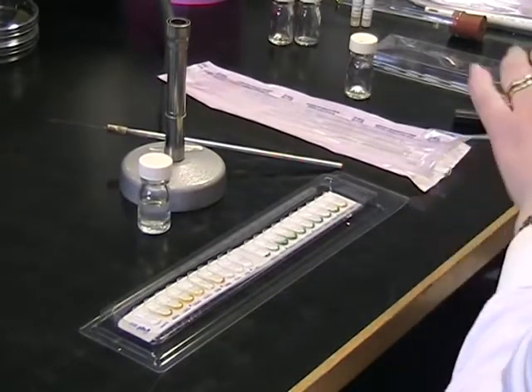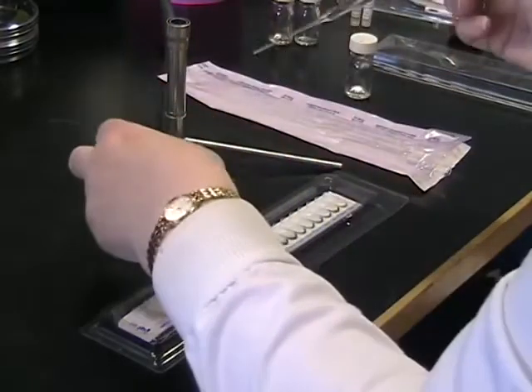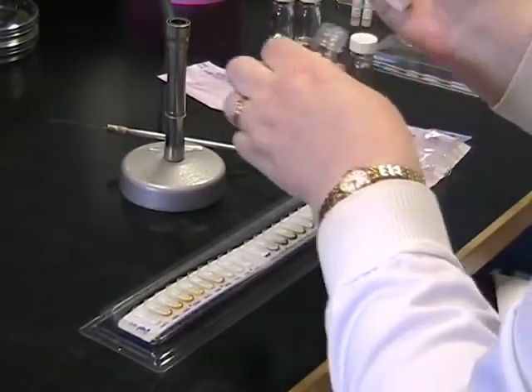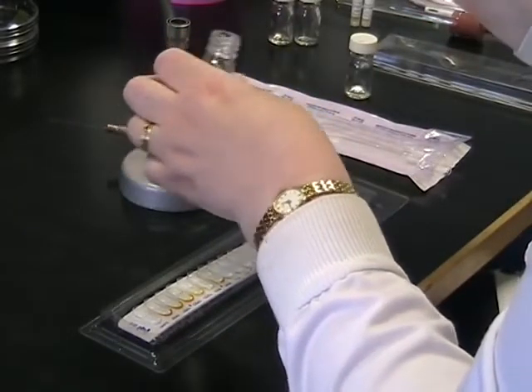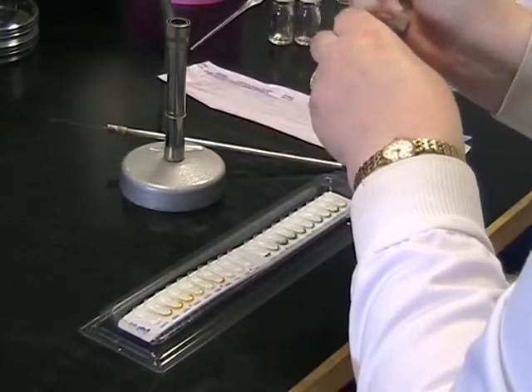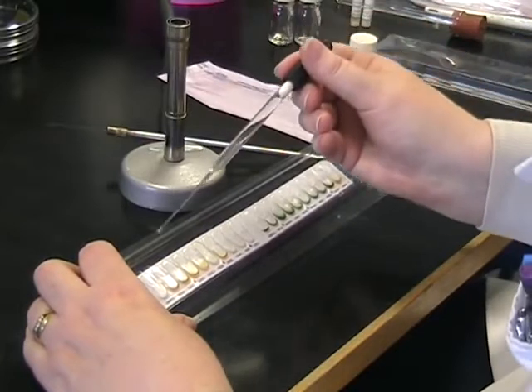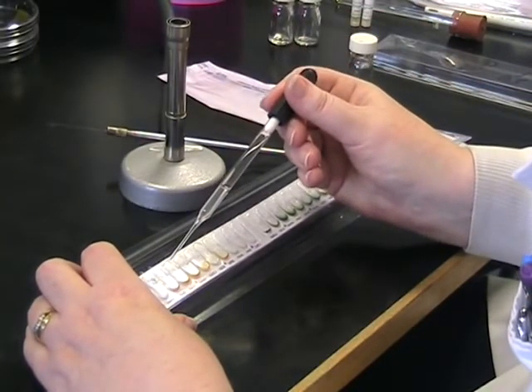Using a sterile pasteur pipette and a teat we're going to add our solution of bacteria into the cupules on the test strip. It's easier to do this when the strip is on a slant. Try to add the bacteria by running them down the edge of the strip and try not to introduce air bubbles.